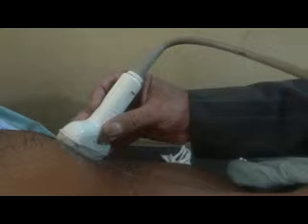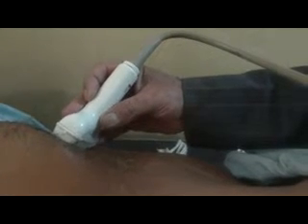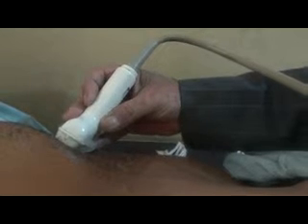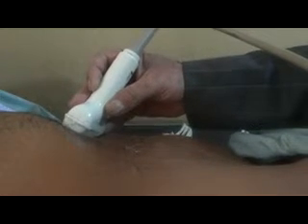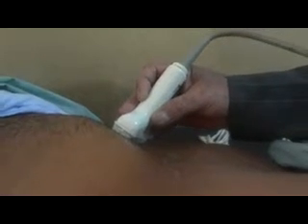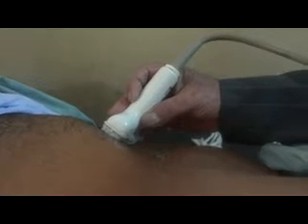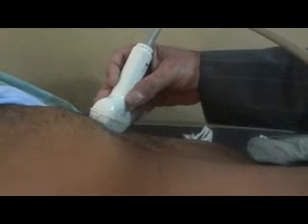Then I will go upwards into the intercostal space — the 6th or 7th — and follow the portal vein towards the patient's axilla. This is the scanning plan for the portal vein in left lateral decubitus posture.